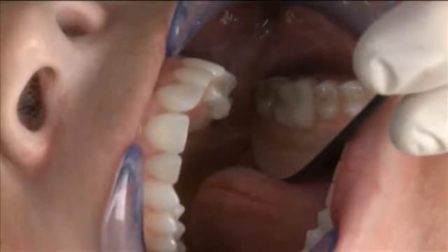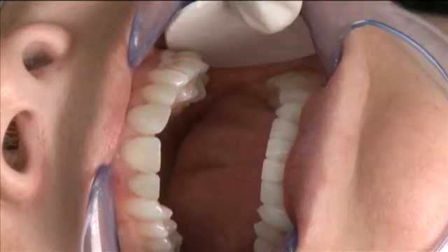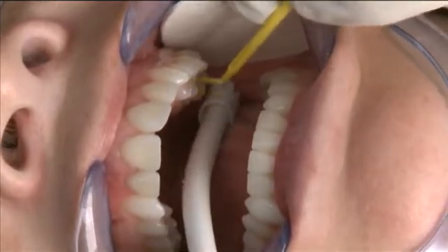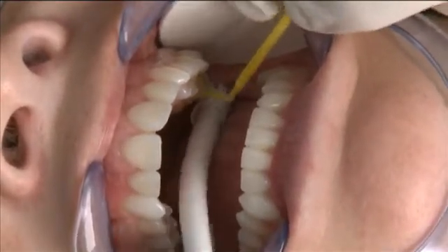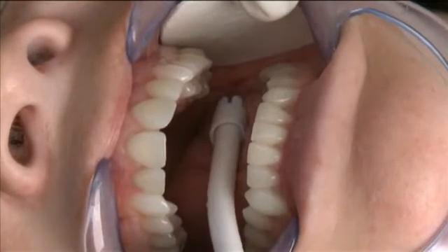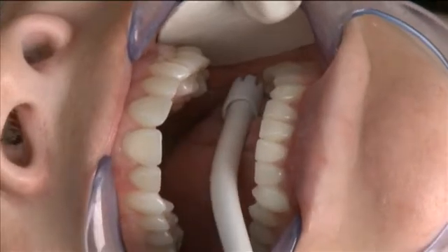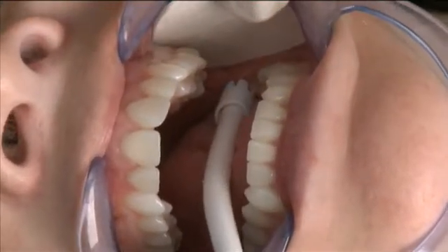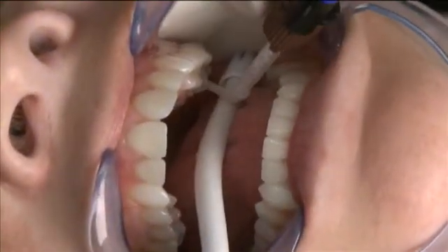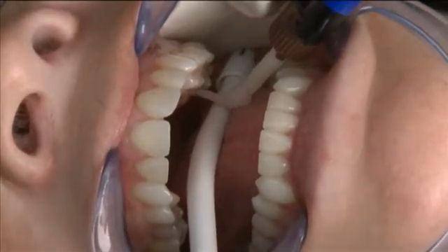Now that we've verified fit, it's time to bond the restoration. I'm going to start by drying the tooth off, and then I'm going to place a coat of unfilled resin and self-etching primer combination, scrubbing it into the dentin for 20 seconds very thoroughly, while maintaining good isolation. Then we'll air thin that just a bit, make sure there is no pooling down to the base of the prep, and then light cure that as per the manufacturer's instructions. Once the light curing is completed, I can go back to the mouth with the resin and coat the preparation surfaces, taking care not to miss any areas and applying a liberal amount of resin along the way.